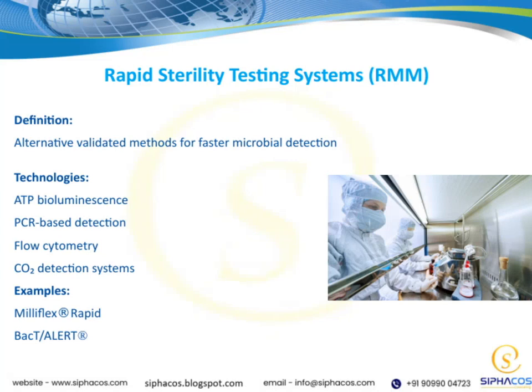Now, let's take a closer look at rapid sterility testing systems, or RMM as they're often called. These are essentially alternative validated methods designed to provide faster microbial detection, which is crucial in maintaining product quality and ensuring timely release. Instead of waiting days for traditional culture methods, RMM offers a more efficient approach.